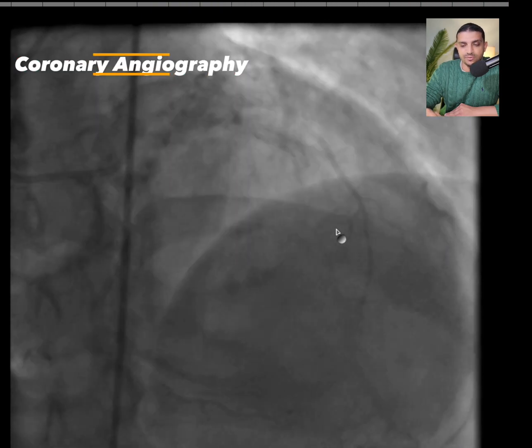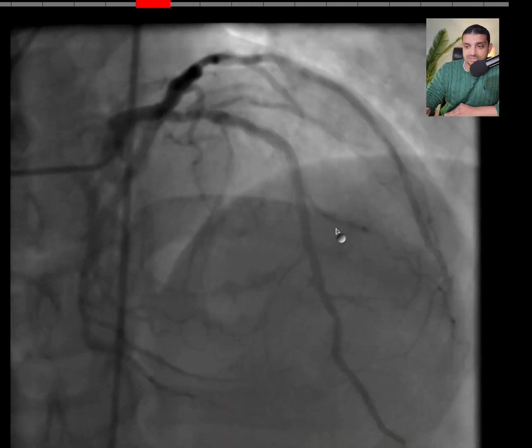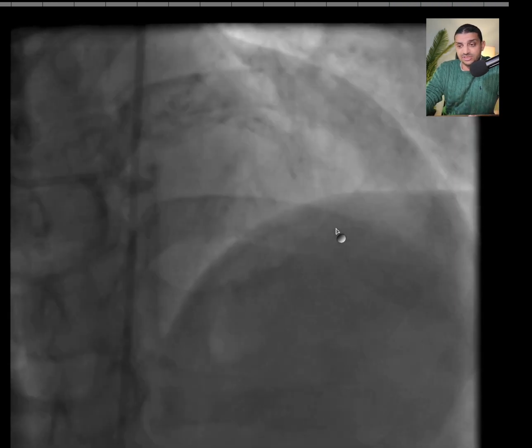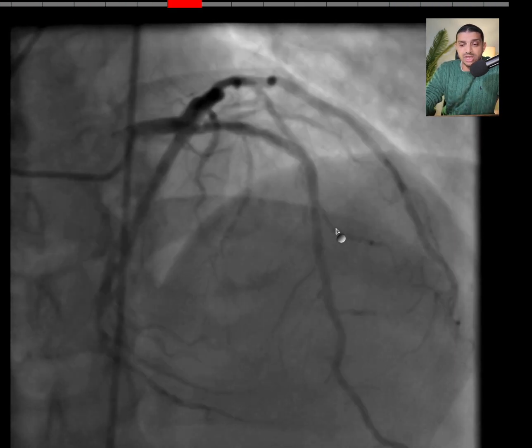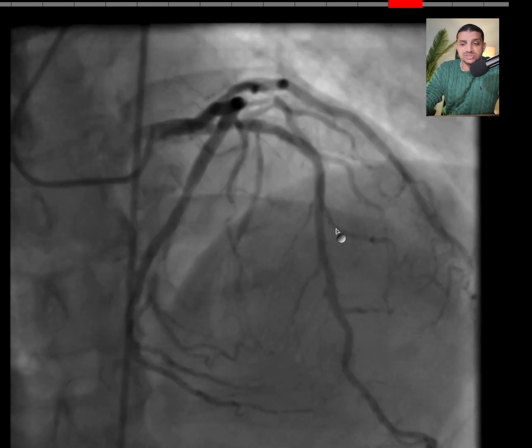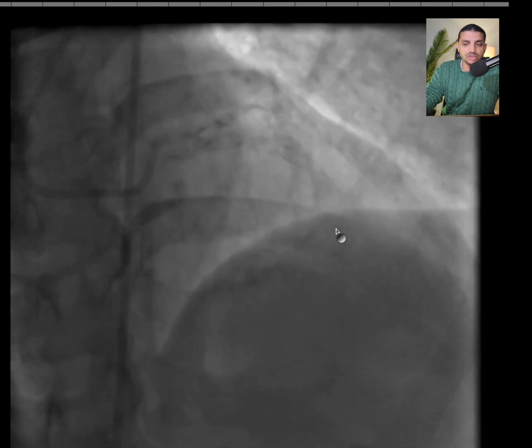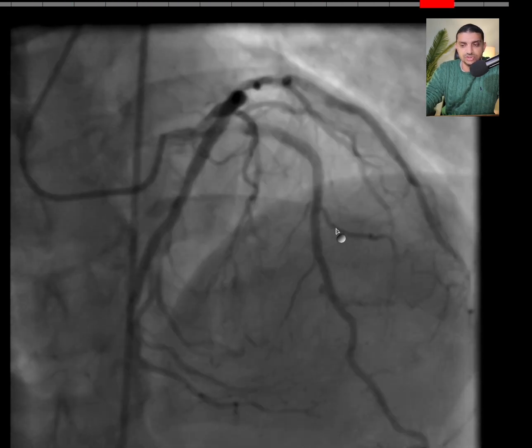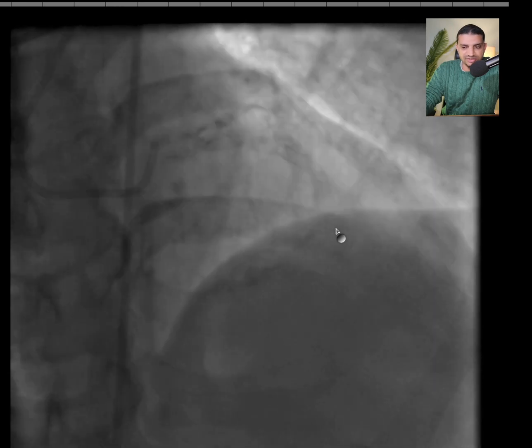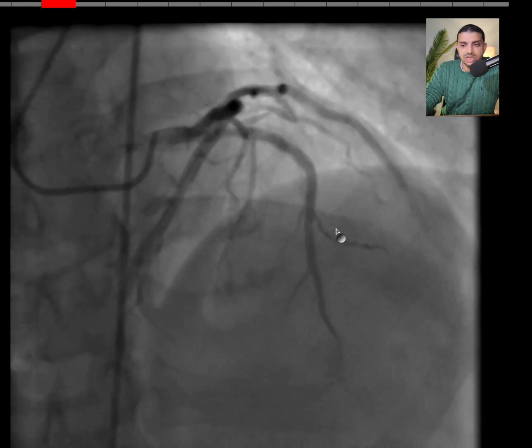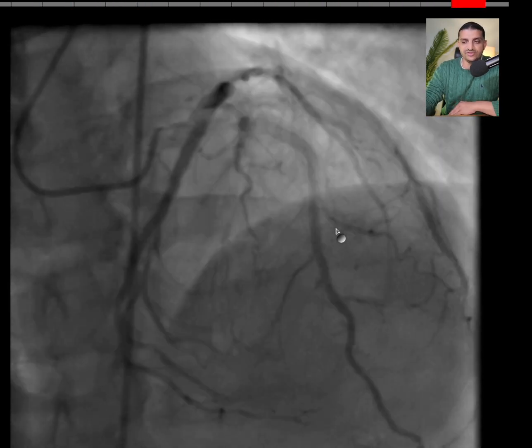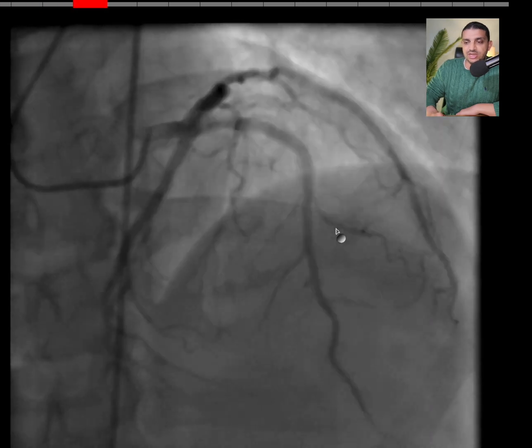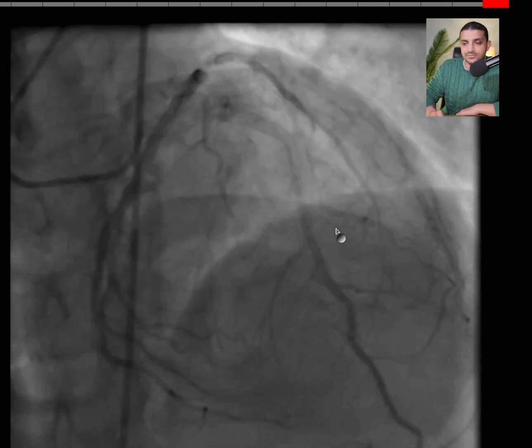If you remember from the CT analysis that we have done, this patient had significant calcification in the coronaries. This is where we have to do the coronary angiography to make sure that there is no significant stenosis. As you can see here, it's not a significant stenosis, and we made sure that everything is good — she has a patent stent and the LAD.